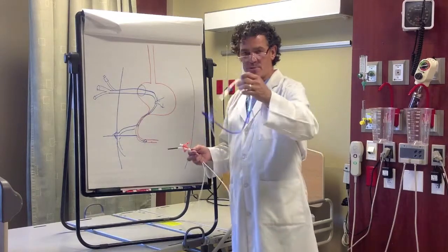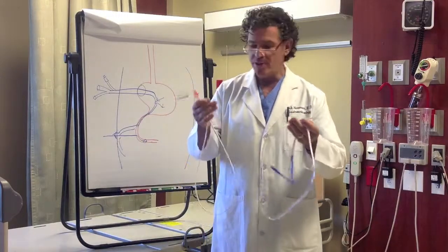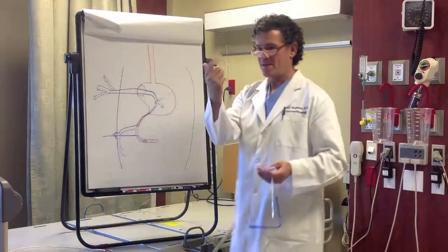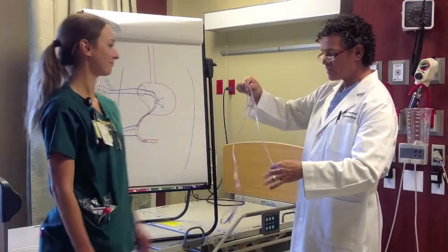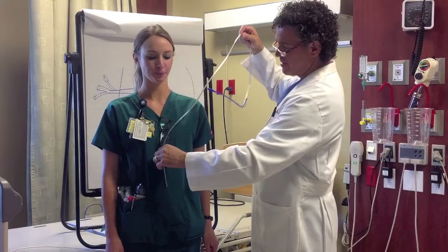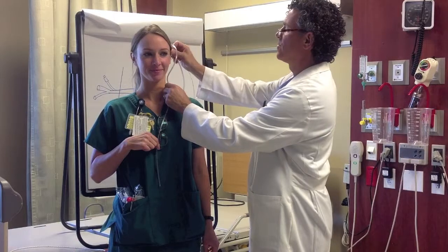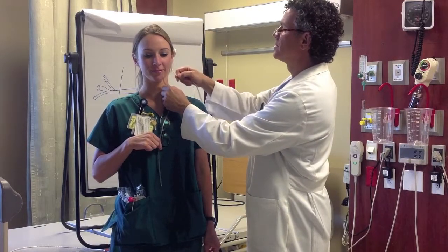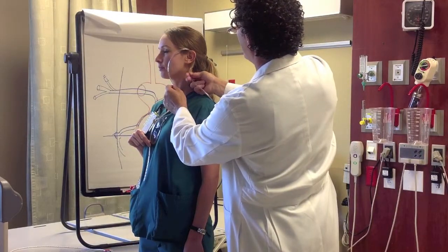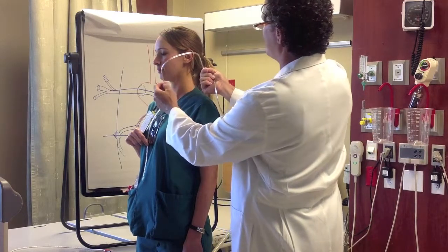I'm not going to spend any more time talking about the NG tube, other than to say how these things are placed in terms of the distance is very similar. And basically the rule of thumb is, come on over here, you put the tip of the tube roughly where you think the stomach is. Can you hold that? And we're going to run it up through the nose and around the ear. Turn sideways. About like that. And where the tube is, right here on the other side of the ear, is about where you want to advance the tube to. And this is at 75 centimeters.